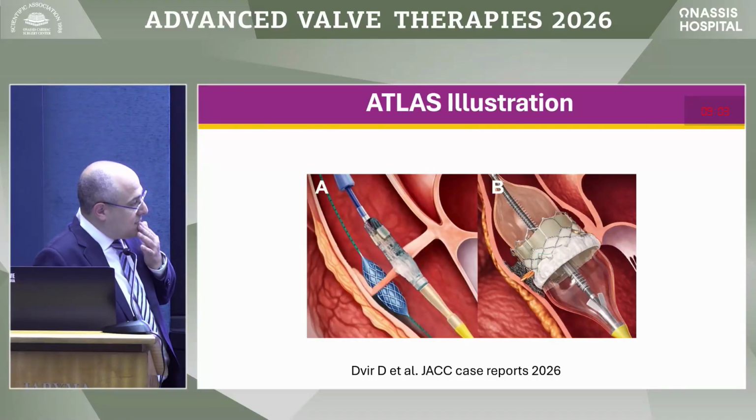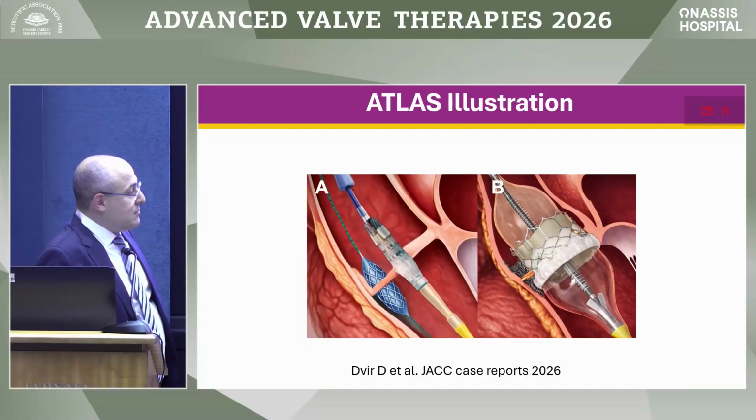Would you consider doing a contralateral, a second, or both B-leaflet stenting, let's say, or would one be enough? Why? In order to have a better anchoring? More symmetric? Maybe because I would have the feeling that it would be more safe, or what do you think?